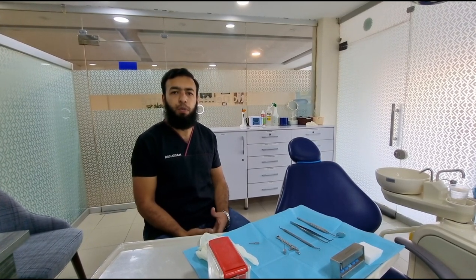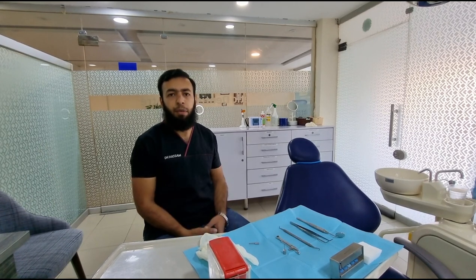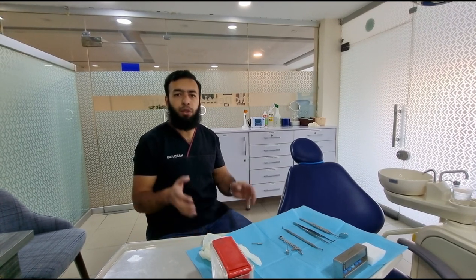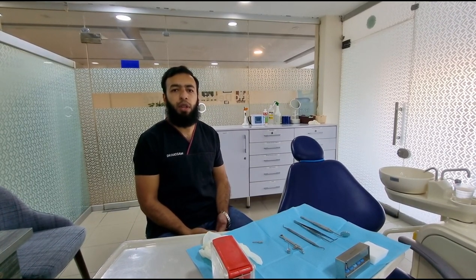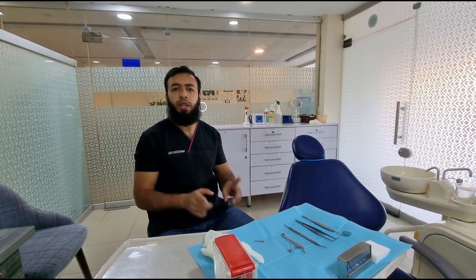There are three ways to gain access to the implant in the second stage surgery. One is that you raise a full mucoperiosteal flap, which is a bit aggressive but sometimes necessary — especially when the bone has grown over the implant or you need to perform additional soft tissue or hard tissue grafting. Second is that you do a micro incision over the implant in which you do not involve the adjacent papilla of the adjacent teeth.